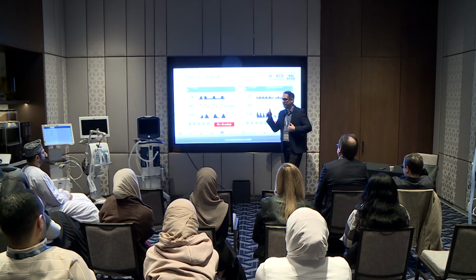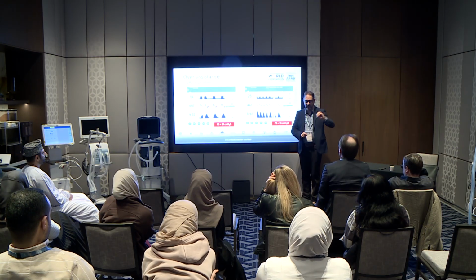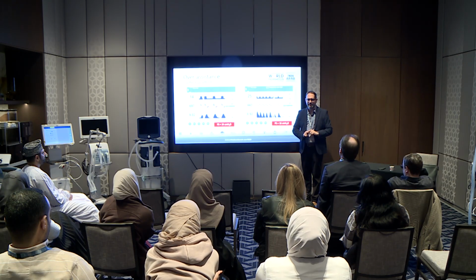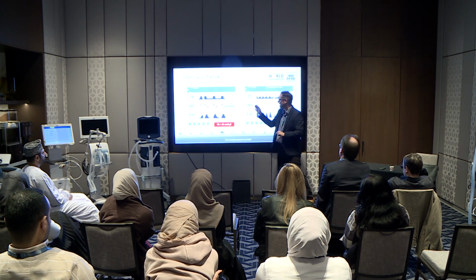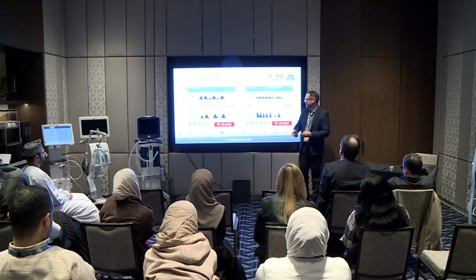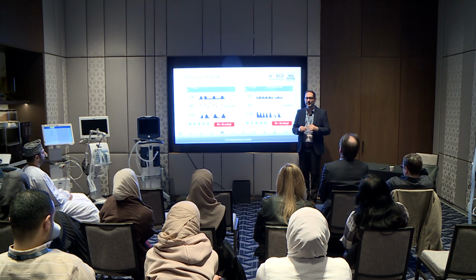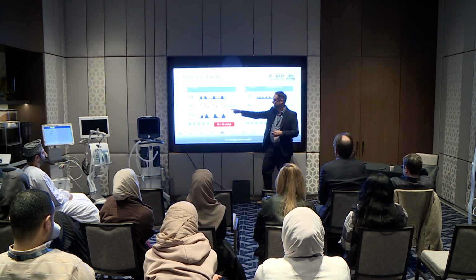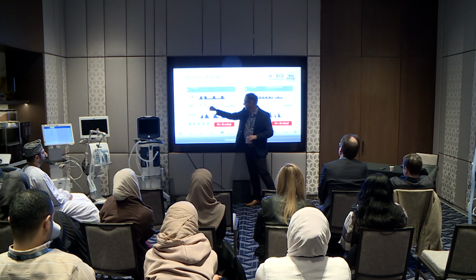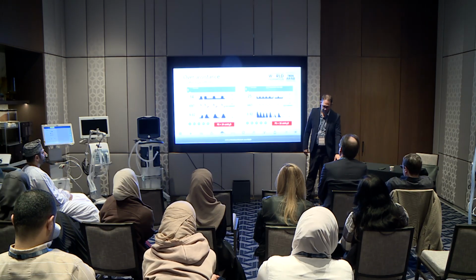So one thing to always note, if you are a respiratory therapist or a physician that is altering this, and you're not letting your nurse know what you're doing, make sure you explain before you do it. I've been into the room many times where I walk in, I walk out, I said, I fixed the patient. What do you mean? They're tachypneic now. This is not tachypnea, but sometimes when you correct it, the respiratory rate's 30 or higher. So understand that the patient's still breathing the same here, you're just masking it, you're hiding it because they can't trigger. But that doesn't mean they're not making an effort. It's there, the ventilator's not sensing it and not triggering the breath.